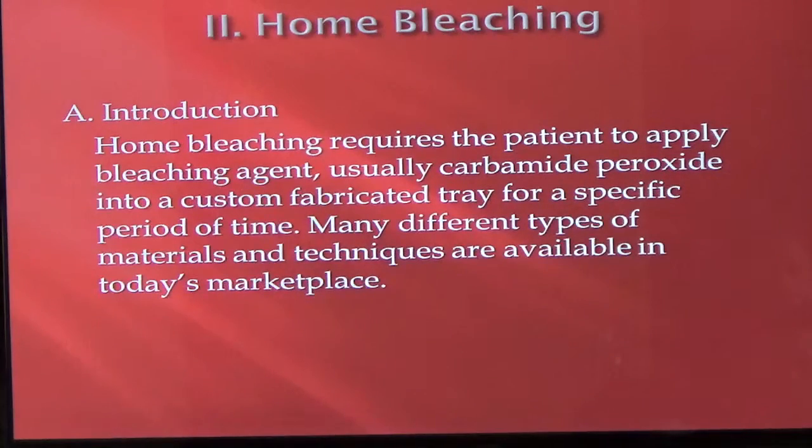We'll do that bleaching, or that's the sealants. Bleaching, we've got some models that you guys poured up of each other. You're gonna trim one model and do one? If we have time too, it depends on the time. We'll start with the upper one since that's the most common.